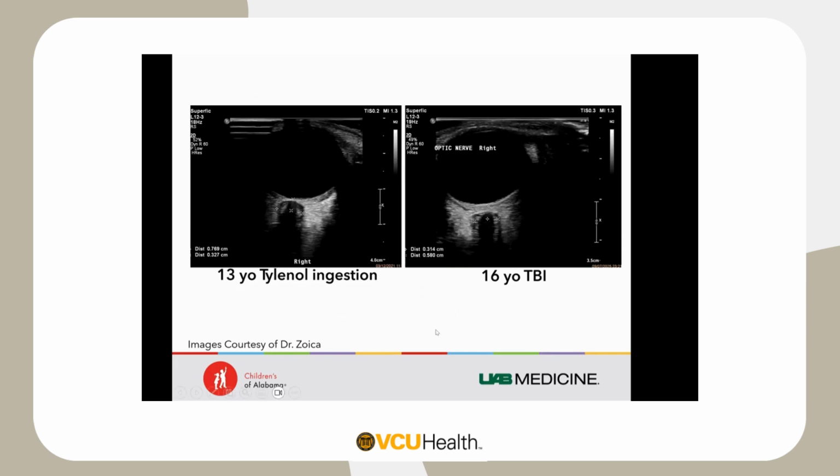And then these are great examples of distended optic nerve sheath. As you can see, these are really great pictures because you can see the whole globe. They're on axis, meaning that this optic nerve sheath isn't way over here when you have the rest of the eye lined up. And then you can see the exterior and interior diameter, exterior being here, interior being here.